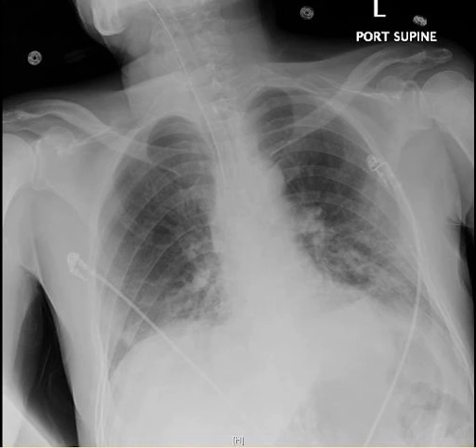The bad thing about that is that's actually not too specific. This is something that we see in a lot of different viral patterns of disease, and especially while we're still seeing some scattered RSV, influenza, and other viruses, those can give you a very similar pattern to what COVID gives you. But on X-ray, that's what you find. One interesting thing is that with COVID, you often do not see pleural effusions.